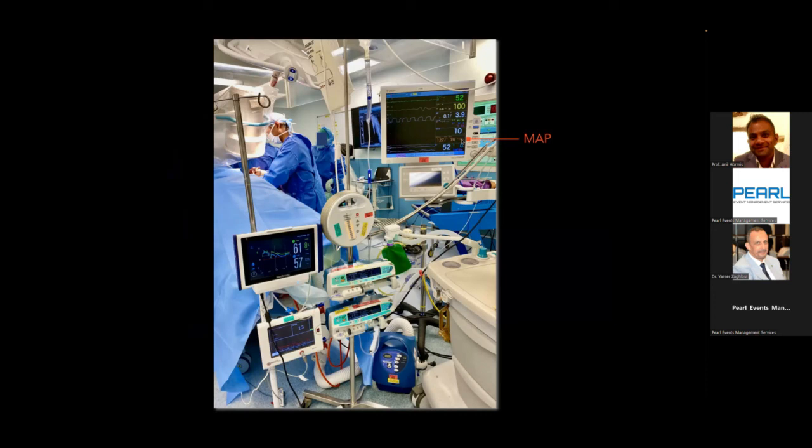And again, for this particular patient, I would never have thought of raising his blood pressure that high, but he'd had a previous stroke. And again, you can see here that he's definitely got problems on the right side of his brain with a reduction of 12% here versus 8% here. The NOL monitor here, you can see is 13, so it's less than 25. And again, it's running very, very continuously throughout the whole time. And I've got him on 2.5 of Remi there, which I've just increased at that point.